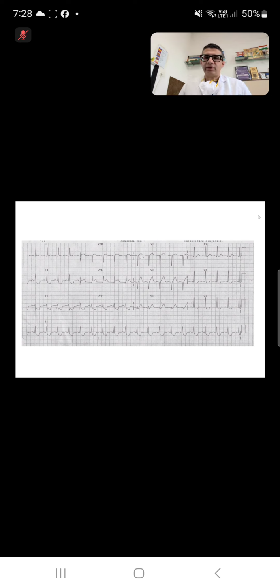What other significance do ST depressions have? Anyone else want to answer that? When you have a patient with STEMI and you have reciprocal ST depressions, what are the important things you want to know about those ST depressions?